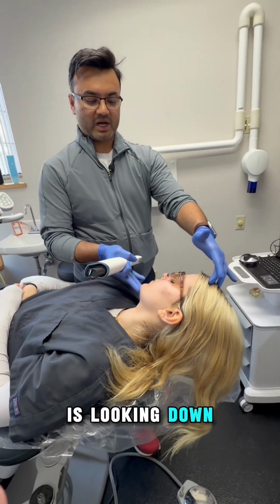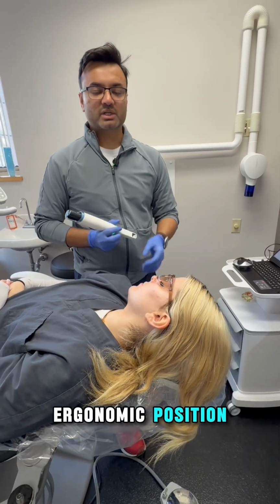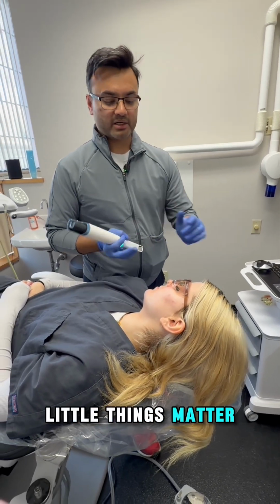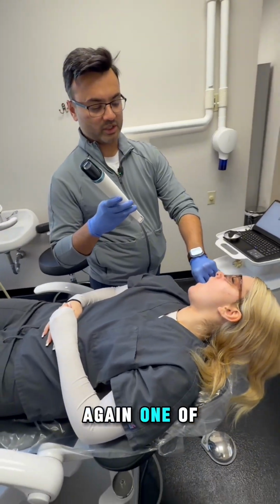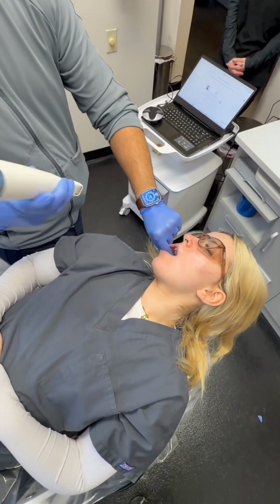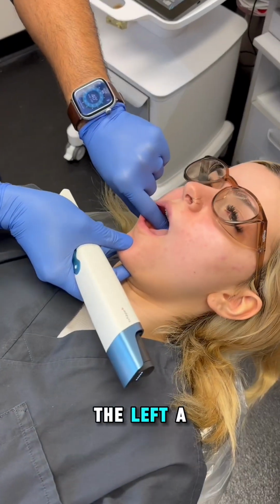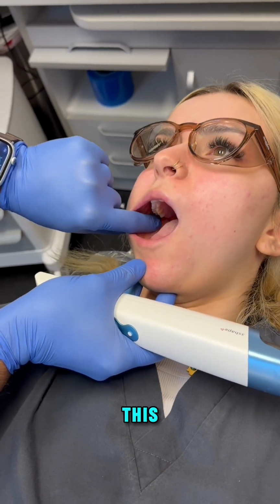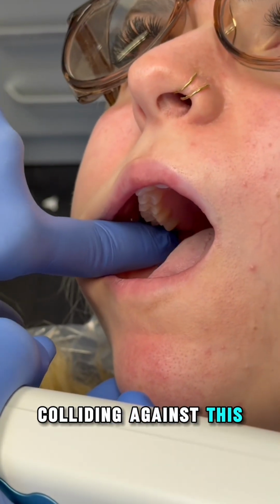When the patient is looking down like this, all the hard work that you did, you lost the ergonomic position. Little things matter. Lift your chin up, open wide. Again, one of my fingers is retracting. When the patient opens wide, now for video purposes, I want you to turn to the left a little bit, open wide, holding this. Do you feel that my finger is colliding against this molar?